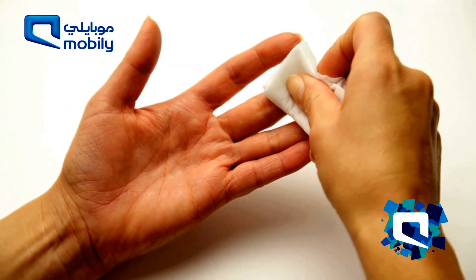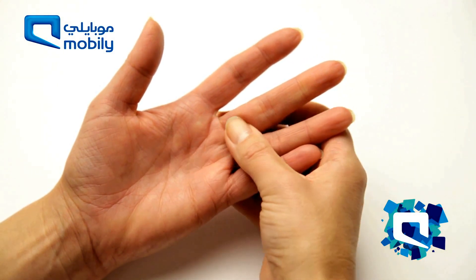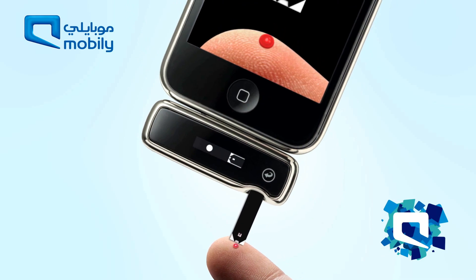Remember to always wipe away the first drop of blood. Then squeeze the finger as shown to obtain a second drop of blood. Bring the tip of the test strip to the blood sample, where it will draw up the blood.